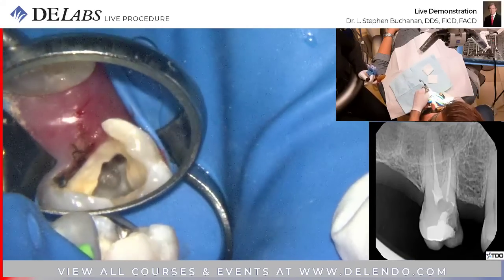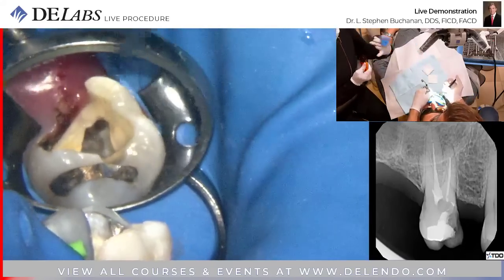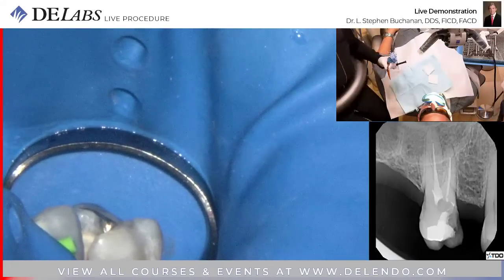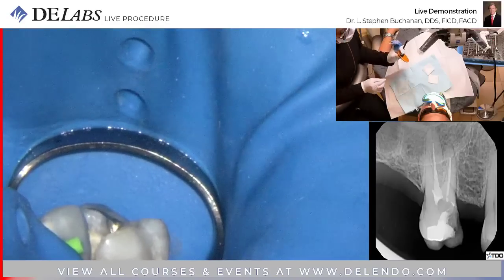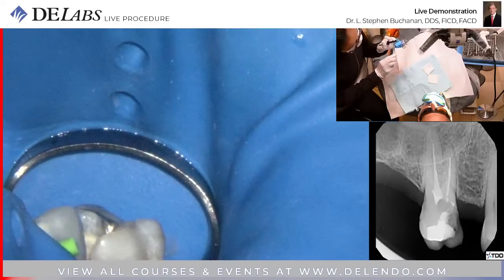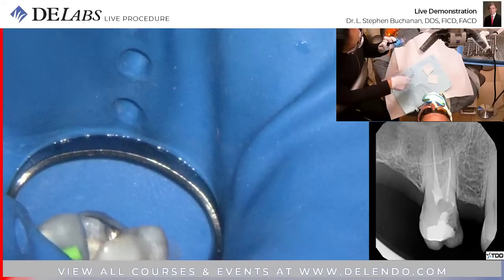So let's go ahead and start building a platform. She's going to put, you know what, let's put some gutta percha cones in those areas. Care for the sponge? Would you like me to put a sponge in it?